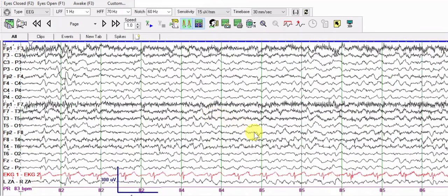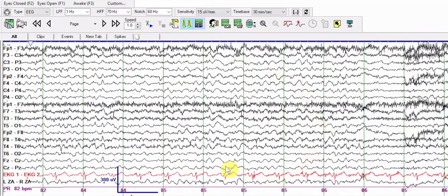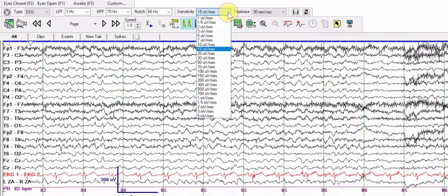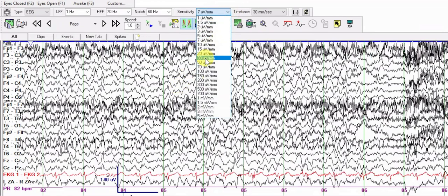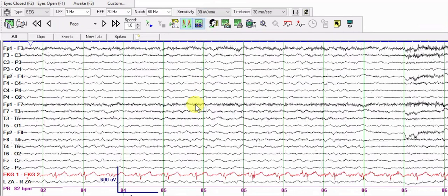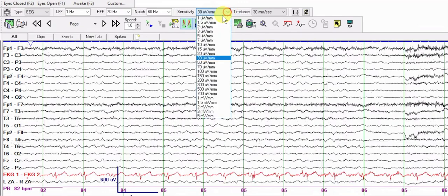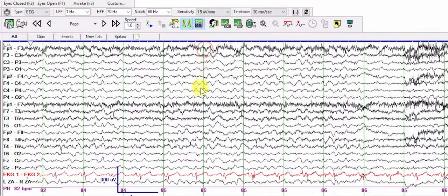Moving on, you can see some evolution in the frequencies — somewhat higher amplitude slowing. Even at 15 microvolts per millimeter you can still see a lot of Delta and Theta activity. For clarity, try different sensitivities: at 7 microvolts you can appreciate how much slowing there is, and at 30 microvolts there is less overlap but you can still see the slowing. Keep in mind that every millimeter represents 30 microvolts, so this is a pretty high amplitude EEG.